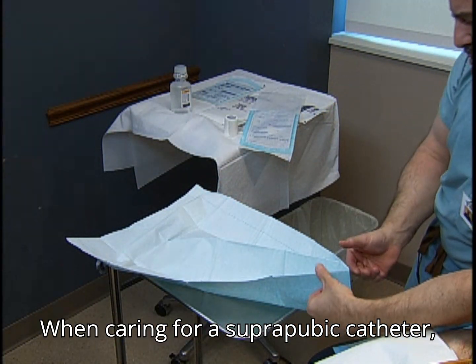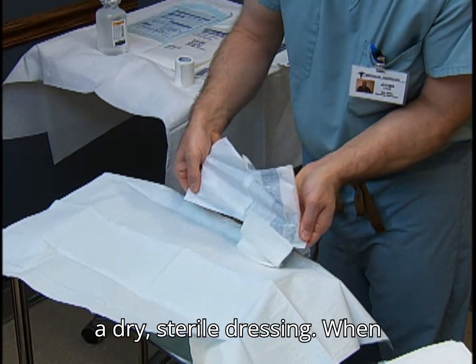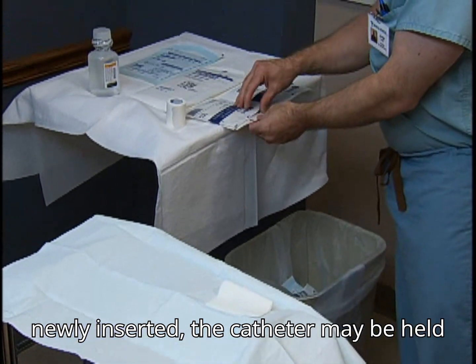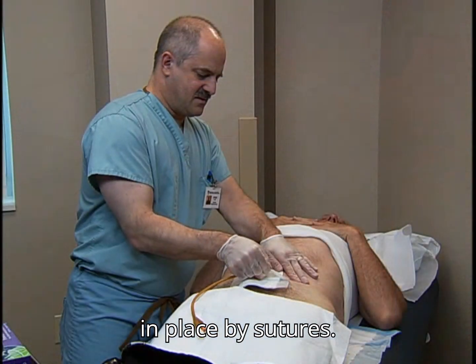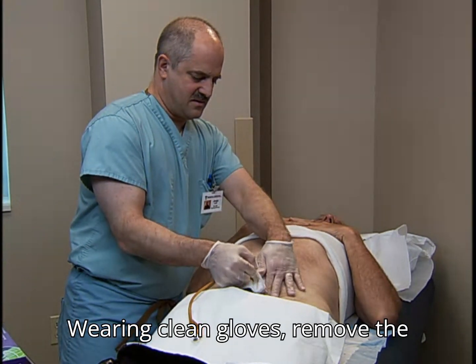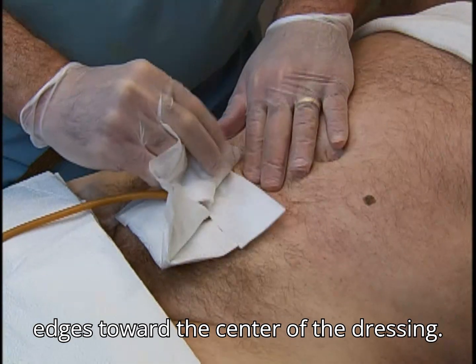When caring for a suprapubic catheter, set up the supplies as you would to apply a dry, sterile dressing. When newly inserted, the catheter may be held in place by sutures. Wearing clean gloves, remove the existing dressing by gently pulling the edges toward the center of the dressing.